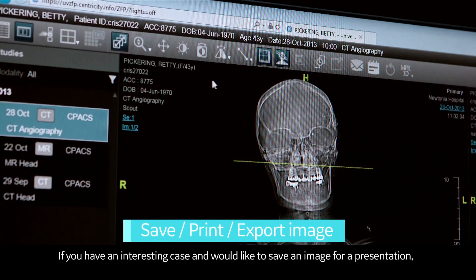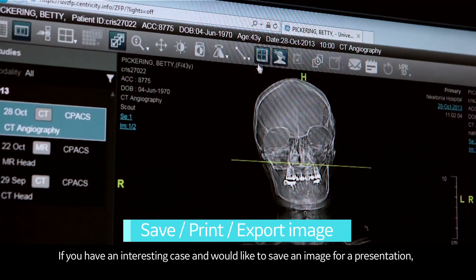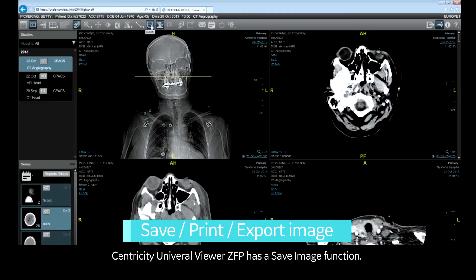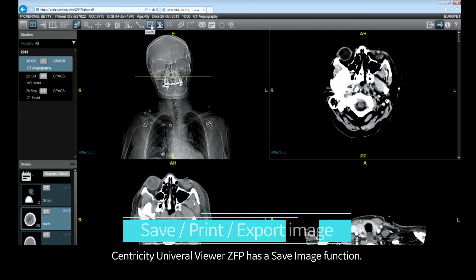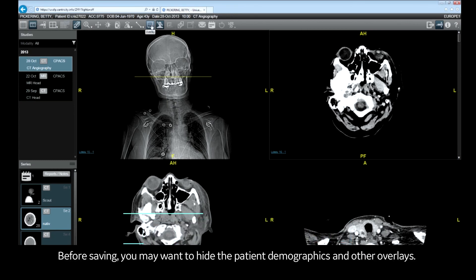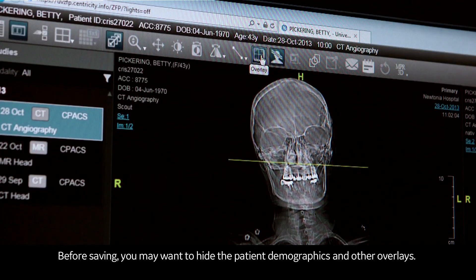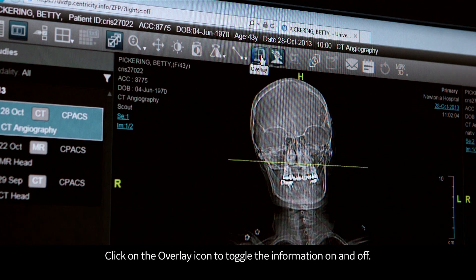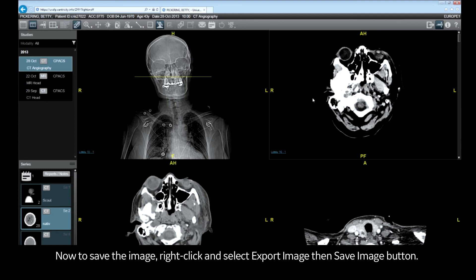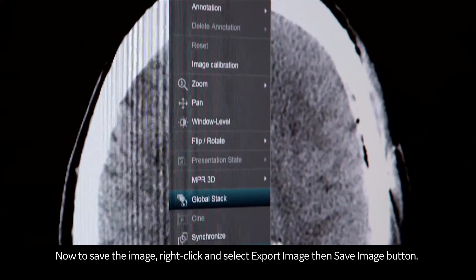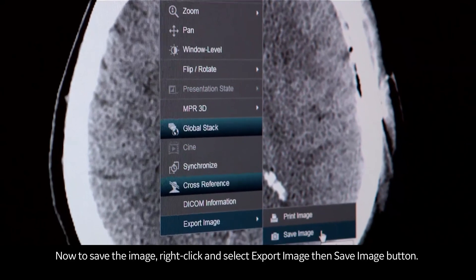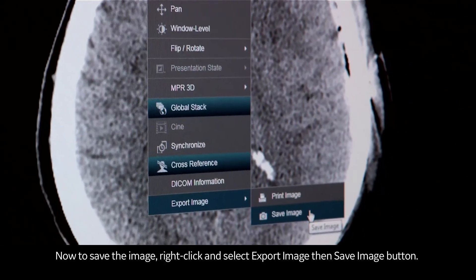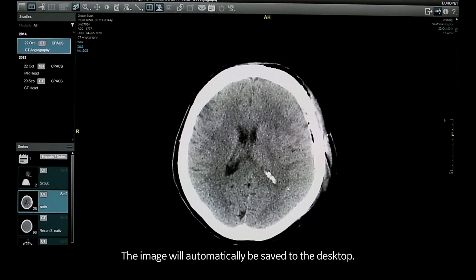If you have an interesting case and would like to save an image for a presentation, Centricity Universal Viewer ZFP has a save image function. Before saving, you may want to hide the patient demographics and other overlays — click on the overlay icon to toggle the information on and off. To save the image, right-click and select export image, then save image. The image will automatically be saved to the desktop.